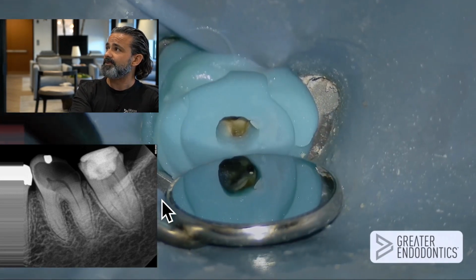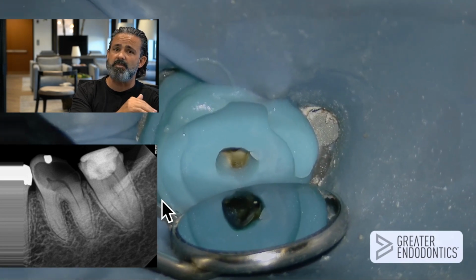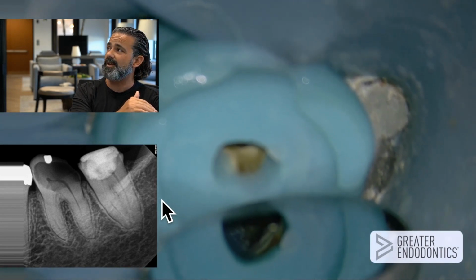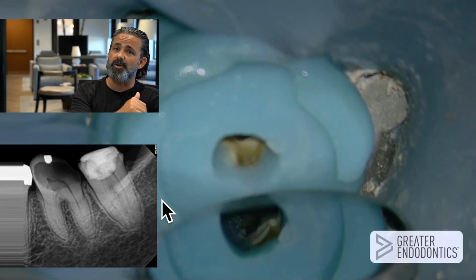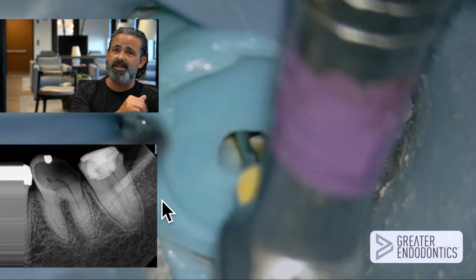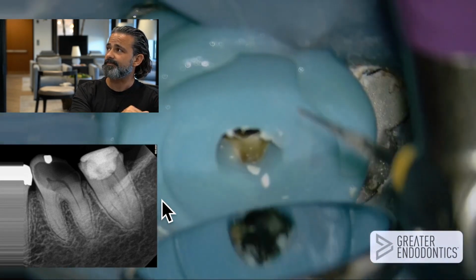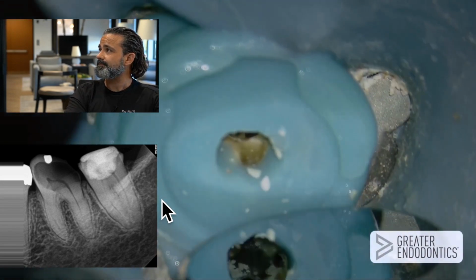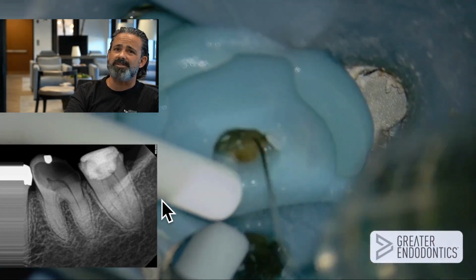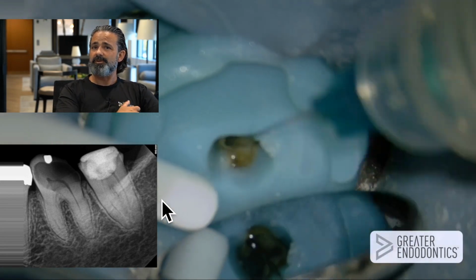All right, let's take a look inside. And you can see that that internal sealer is bonded to the floor on that buccal wall right there, specifically the mesiobuccal line angle, because that's where I was encroaching upon it. So because of that, I'm going to pass a file in there and make sure there's just no sealer on top of the orifice. And then if you get a lot of debris, dentinal mud from that process, just take your syringe back in there and flush it out again. It's what we do.